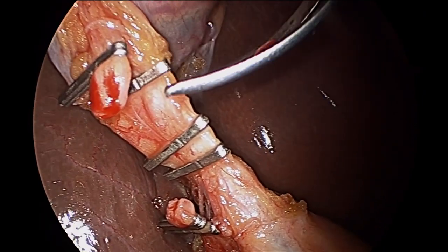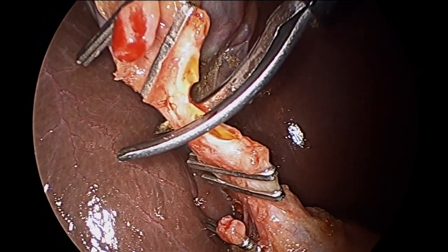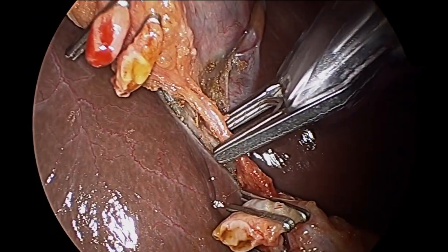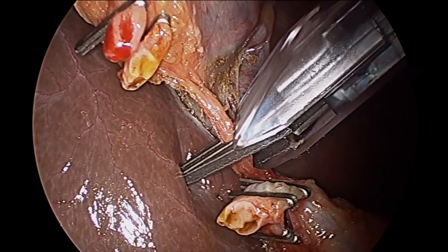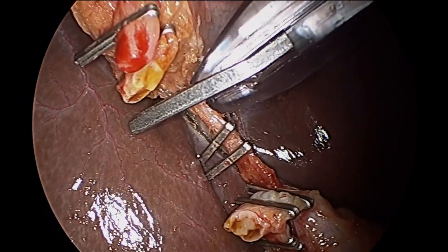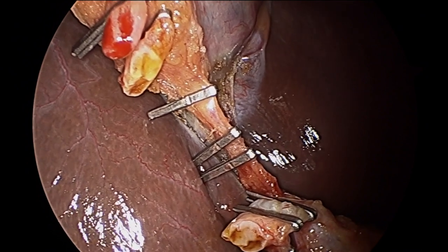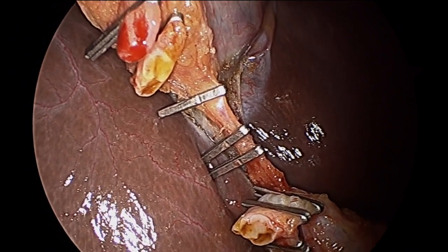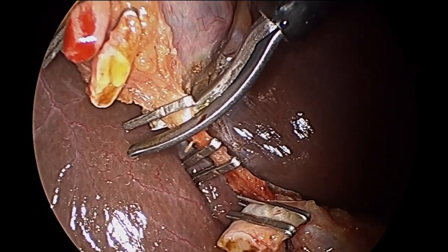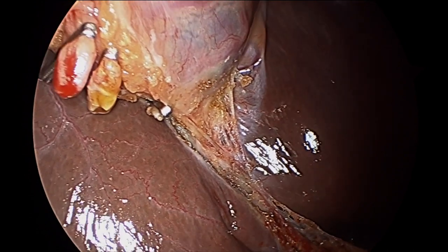This all has to be carefully dissected to minimize bleeding and tissue trauma. That yellowish fluid confirms the cystic duct had been isolated, and here come the surgical clips again — they're titanium, they stay in your body, and you'll make a scar over them. We're isolating the posterior branch here and introduce a pair of scissors to separate that. And that's it — anterior branch, posterior branch, and cystic duct are all isolated.